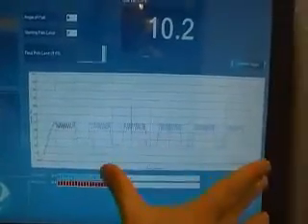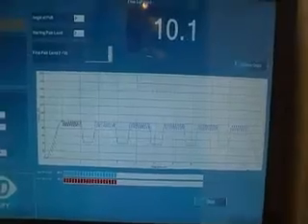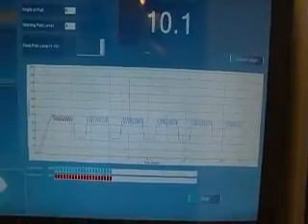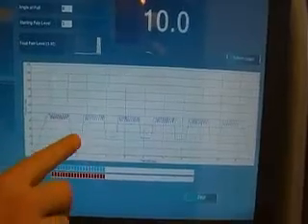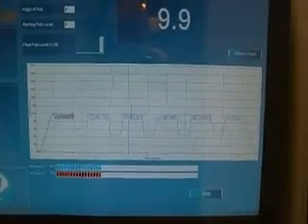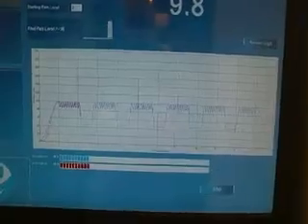If we come back to the screen, we're now coming to the end of the first minute. We've set this just for a demonstration as a 12-minute cycle, and we're going to come back down now to the low tension, which is just above 40 pounds — about 20 kilos. So the soft tissues are going to be under a constant tension. As we come around here again, we can see the tension has now come off and is then held.